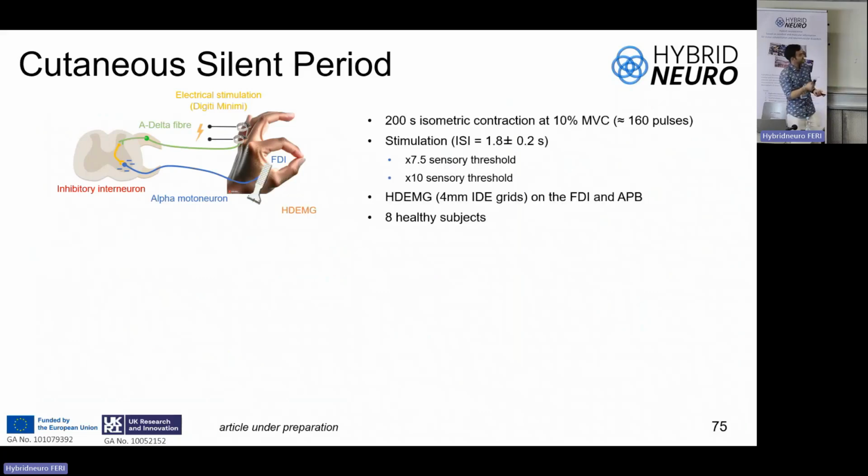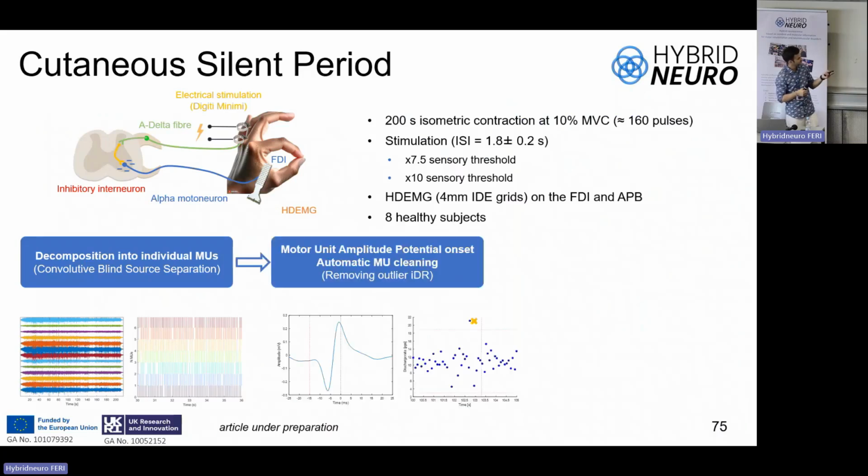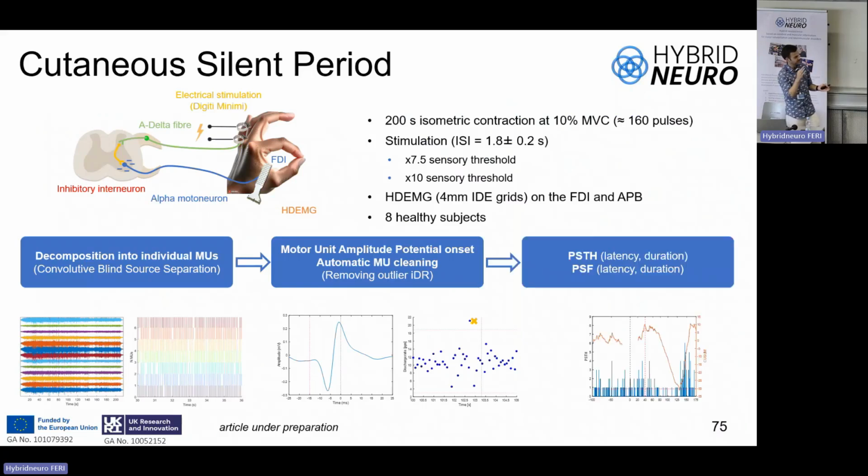So instead of using needles, let's use high density EMG. Tested in a few healthy subjects, we're increasing the cohort. We corrected the shift for the motor unit action potential onset, and we removed some outliers because we have very long recordings, like 5-minute recordings. In the FDI, it might be fine if you have 10 units, but we also did this for the TA. If we had to edit 5-minute recordings for the TA with 40 units, I would be dead and I wouldn't have finished. So we just removed the outliers, hoping that the averaging method will compensate for the errors and allow us to see the results we want to see.